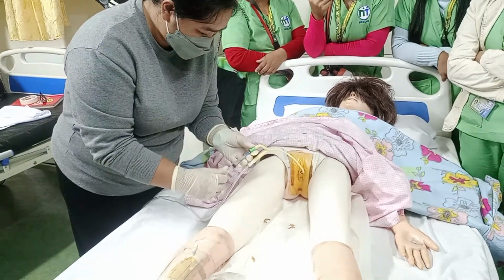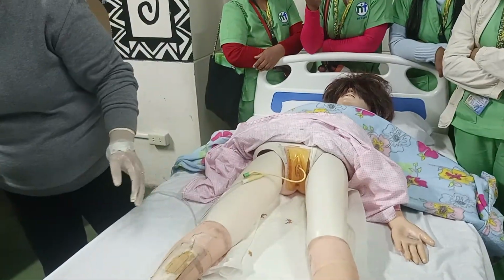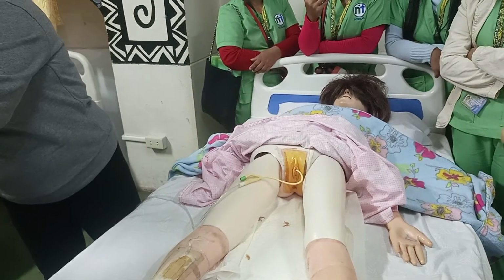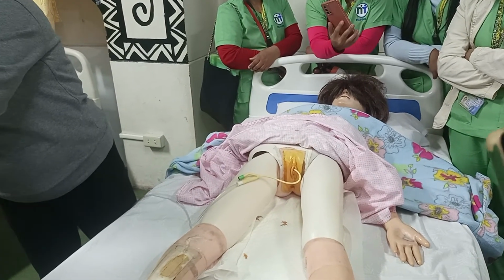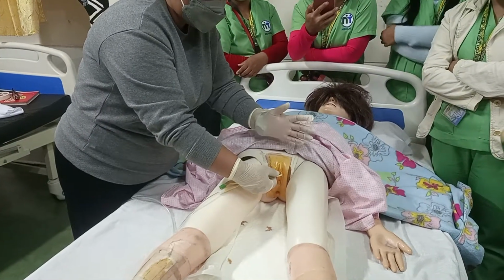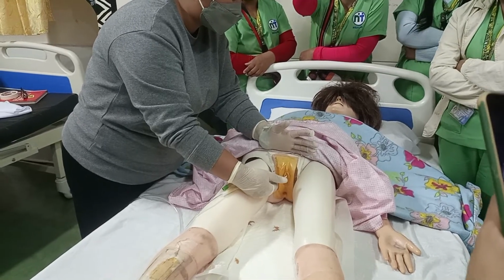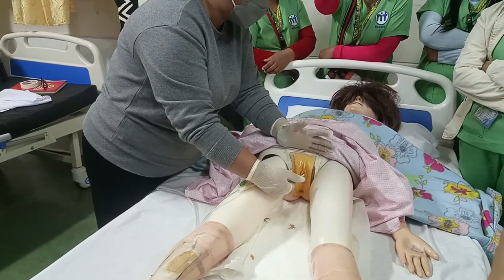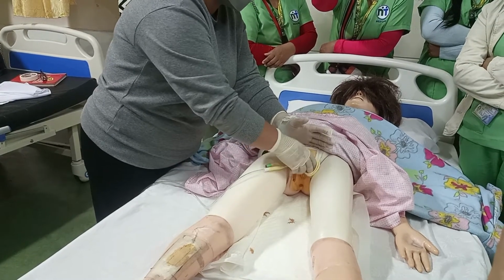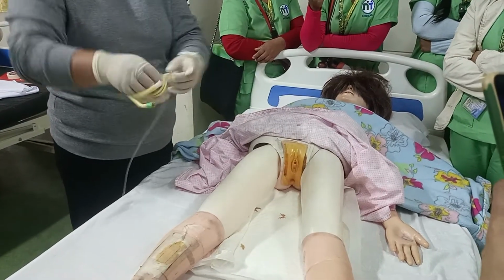Okay? Then, fish out. Fish out, para hindi kayo matusok. And then, hawakan ninyo. Ma'am, at the count of 3, please take a deep breath and I will pull the urinary catheter. 1, 2, 3. And then, inirroll ninyo dun sa kamay ninyo. Okay? Paglabas, ganyan na ang itsura.